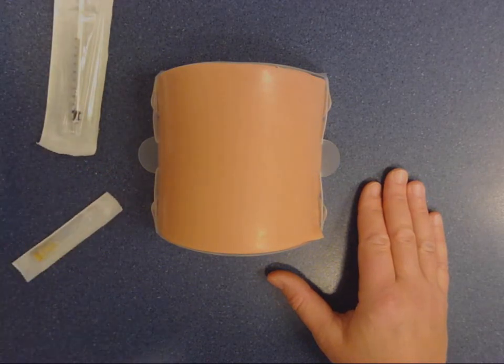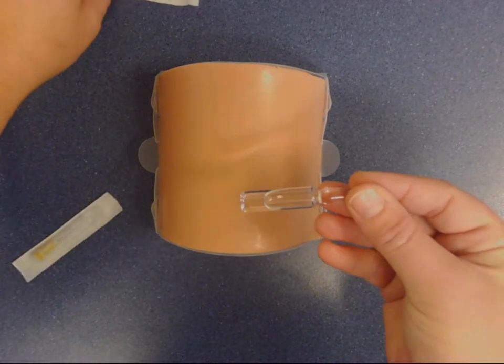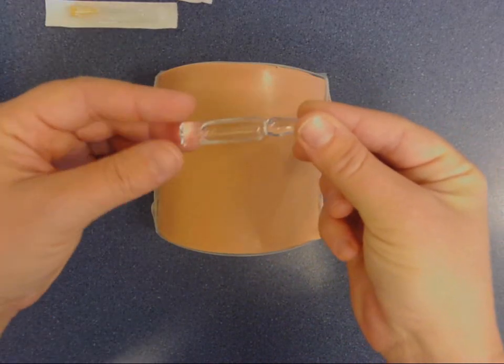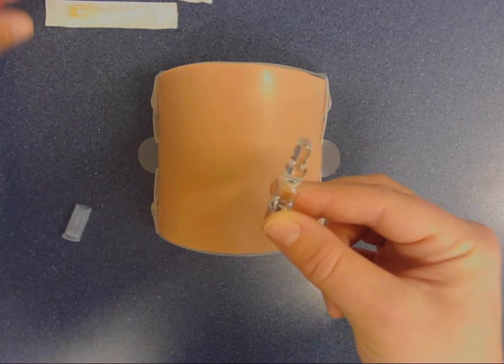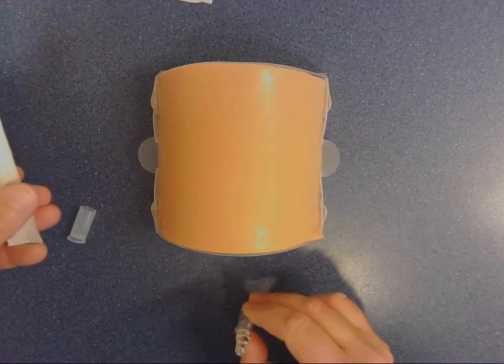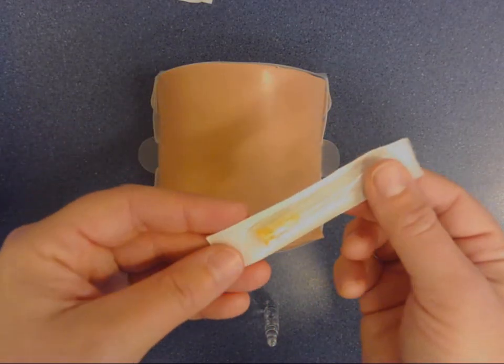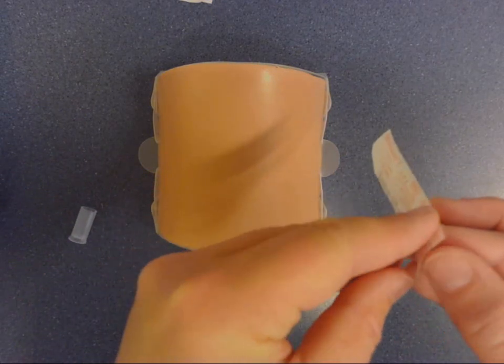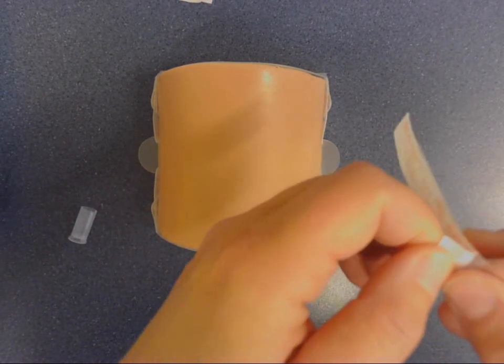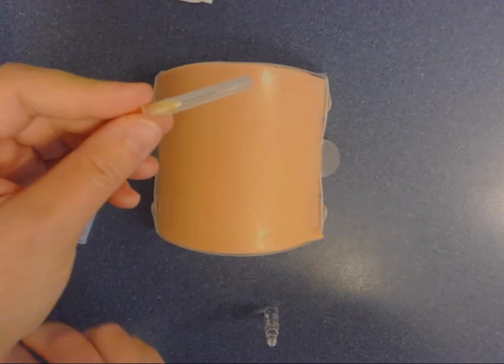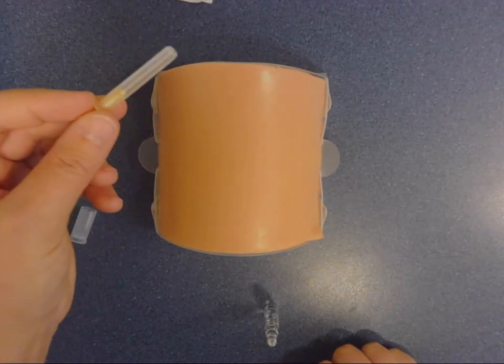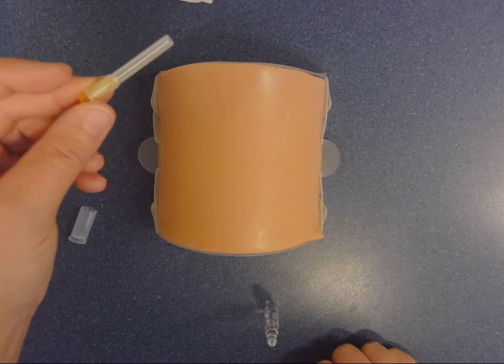We're going to draw up our drug from a glass vial, and we're going to draw up our drug with the smallest needle that we've got available. So in this instance, it's a short orange 25 gauge needle.